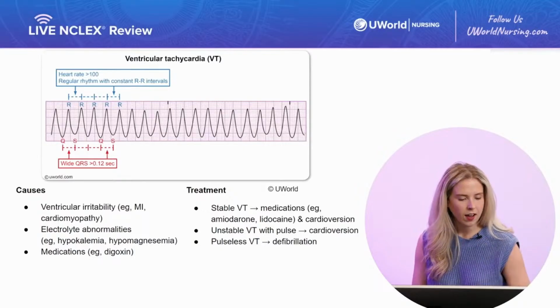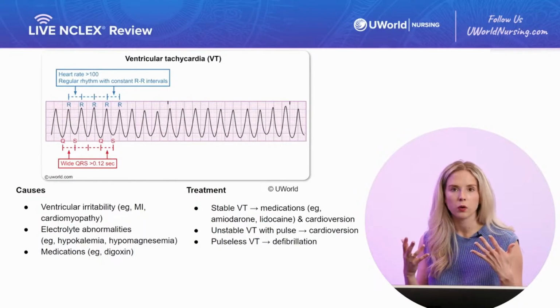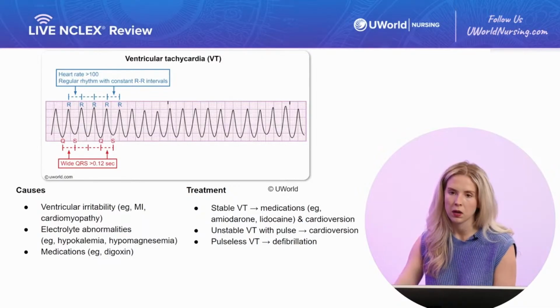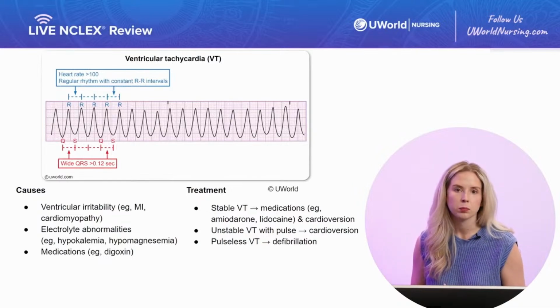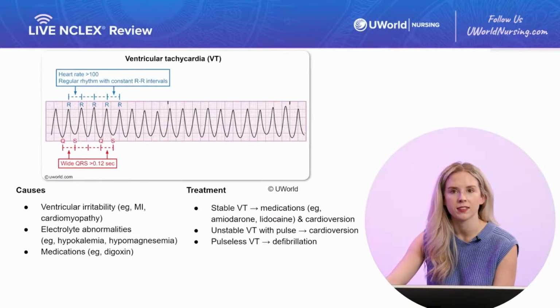And I see on TikTok, Hilda Joel already got it. CPR. Yeah, there's no pulse, so we need to make sure we're trying to keep that perfusion. We're trying to manually stimulate the heart to beat. We're giving that CPR. We need to deliver these chest compressions to get oxygen to these clients and follow those ACLS protocols. Alrighty, so great job, you guys. You guys nailed that one.